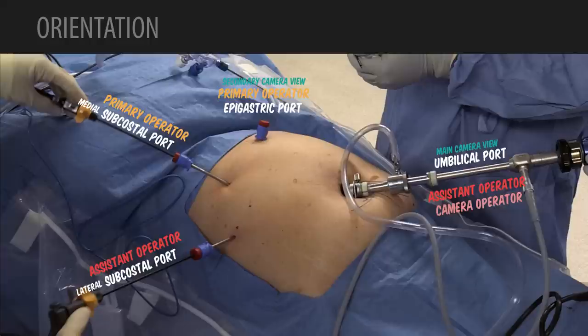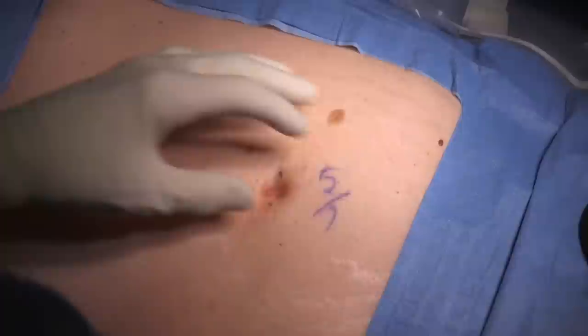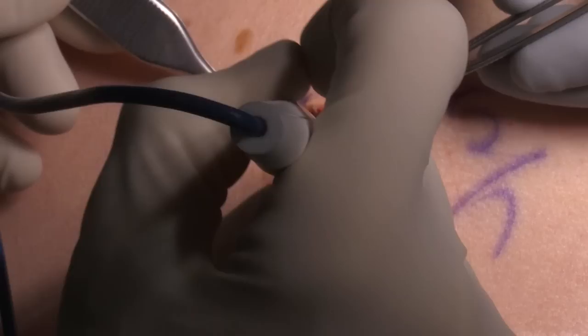This shows the outline of the port placement that we're going to use for this operation. The initial access to the abdomen for this case is going to be through an umbilical transverse incision. We are using an open access technique in which the umbilical fascia will be opened transversely directly into the peritoneal cavity and then we will use a Hassan type cannula to insert and then inflate and put our initial camera port in.